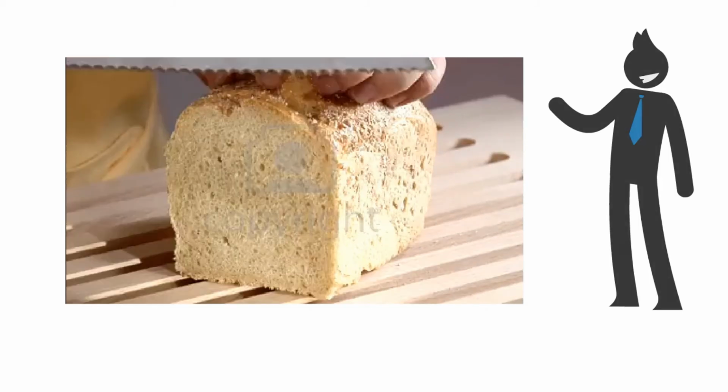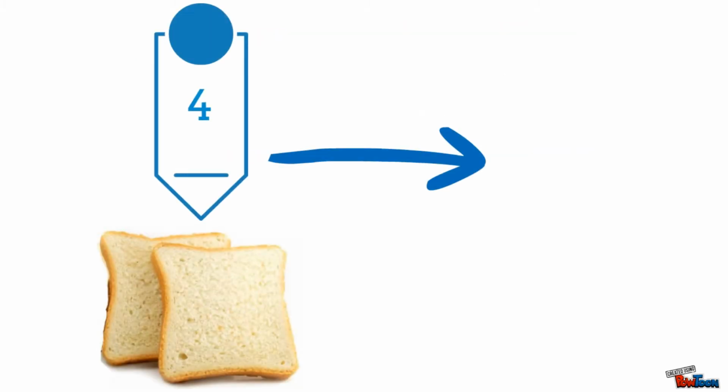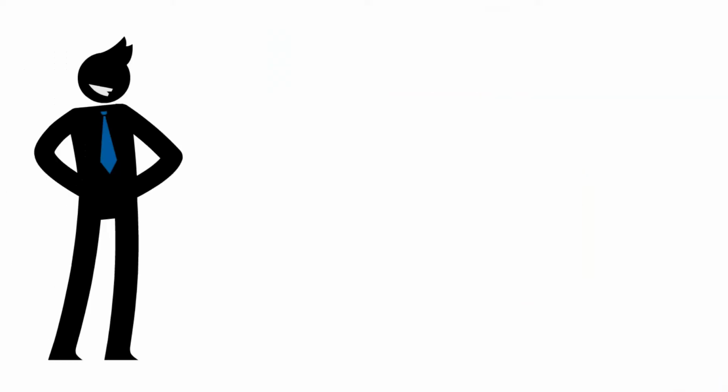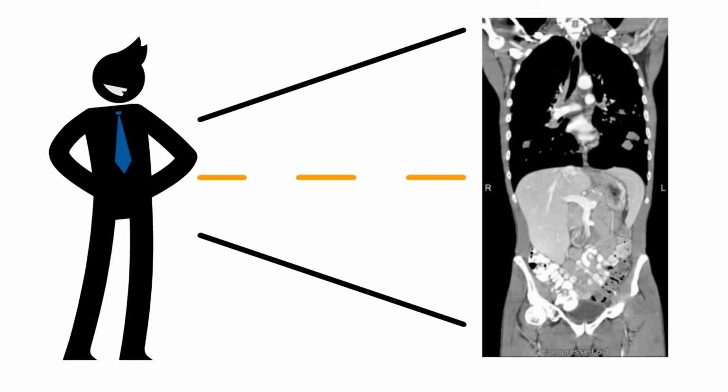As each slice is cut, we are able to see more detail. Most modern scanners now have the ability to image more than one slice at a time. This may range from 4 to 320 slices, and for the most recently developed CT machines it can be as much as 640 slices at a time. Whole-body CT screening is just as the name states. It typically involves scanning the body, from the chin to below the hips.